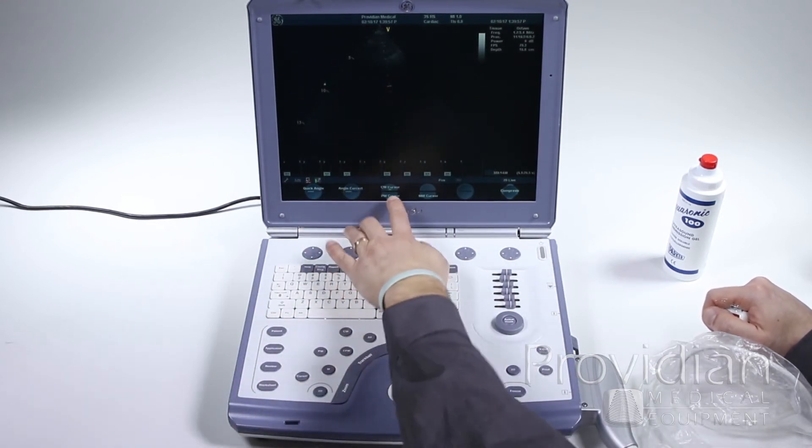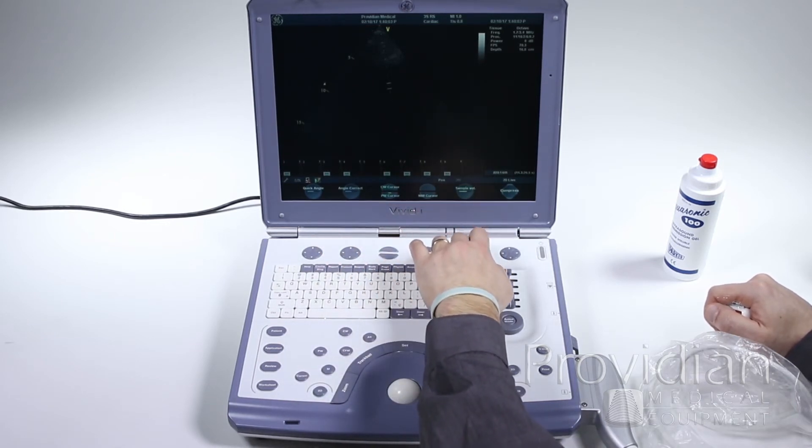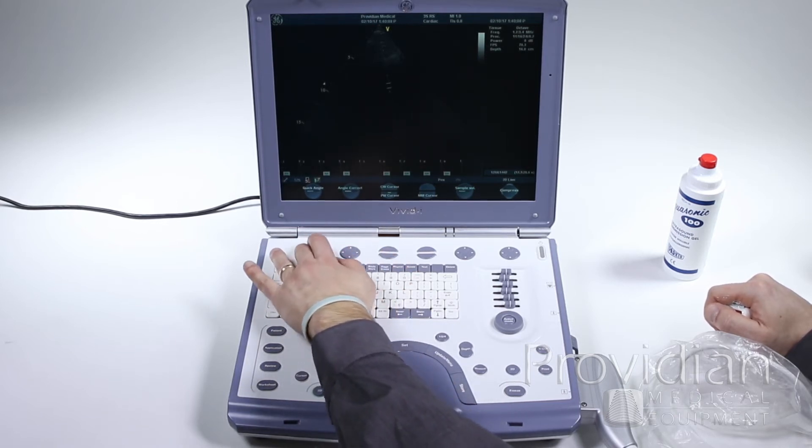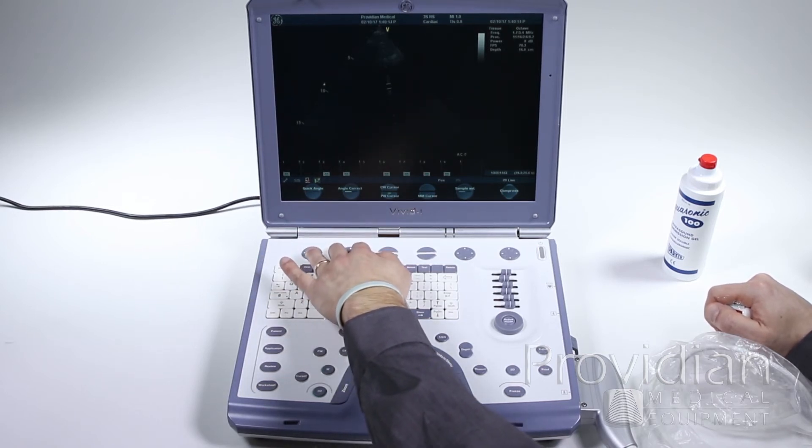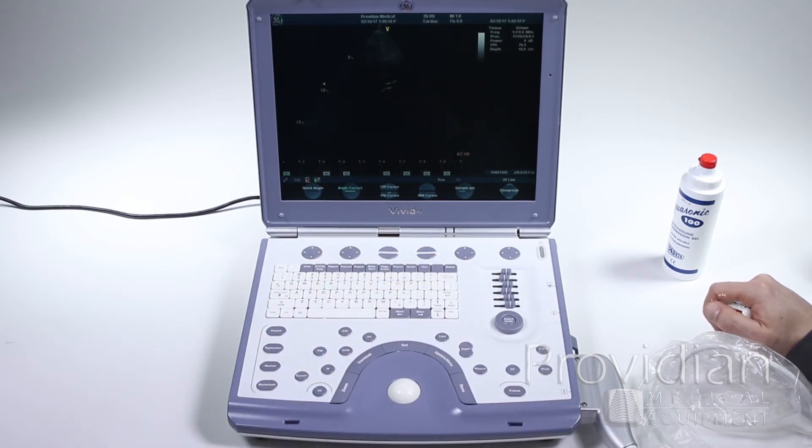And now you can't see the gate there, but if I want to select my PW cursor here, I can change my sample volume gate here, my angle correction, the smaller or the quick angle which goes by 10 degrees real quick, or my angle correct, I can scroll that all the way up. If I want to go to 60 degrees, I can leave it right there.